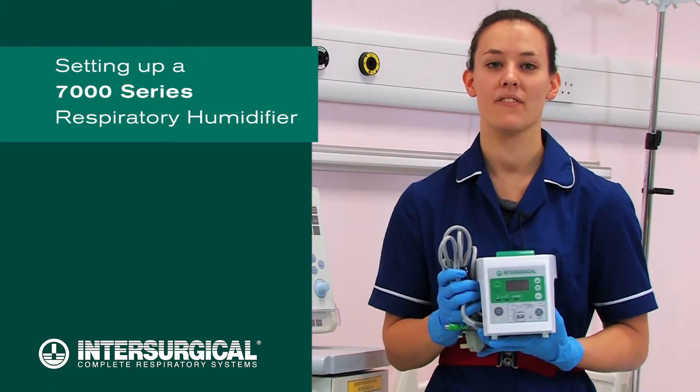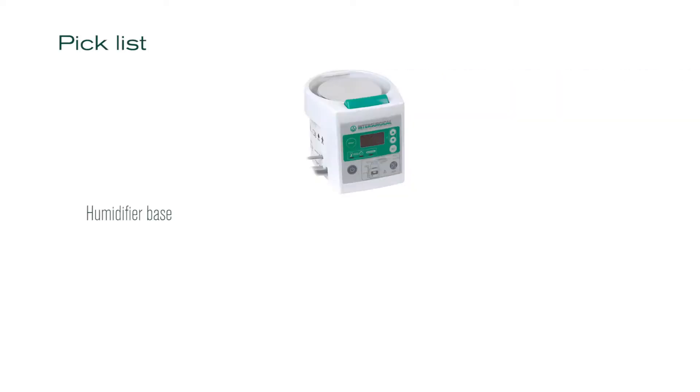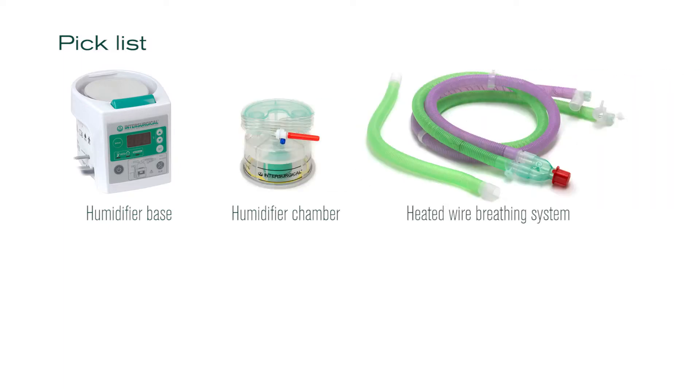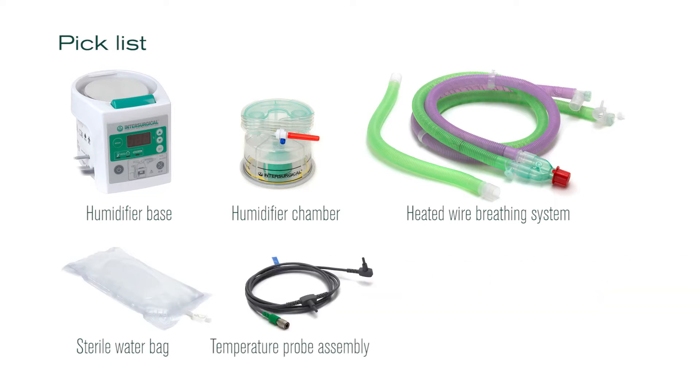I'm Amy and I'm going to show you how to set up a 7000 series respiratory humidifier. You will be using a humidifier base, a humidifier chamber, a heated wire breathing system, a bag of sterile water, a temperature probe assembly, a heated wire adapter and breathing filters.